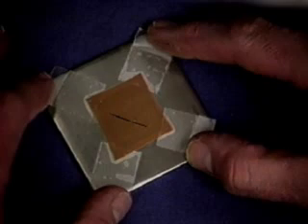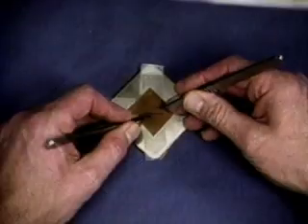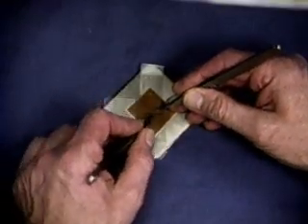Throughout this tape, I've been working in the direction that's easiest for a right-handed person. That's with the needle passing from top right to bottom left. That's the best direction to use when you're first starting out. But in clinical surgery, you'll need to be able to suture in any direction. Once you've thoroughly mastered the basic moves, you can say goodbye to the easy position. Turn your practice piece round and learn to do good work in these different directions.